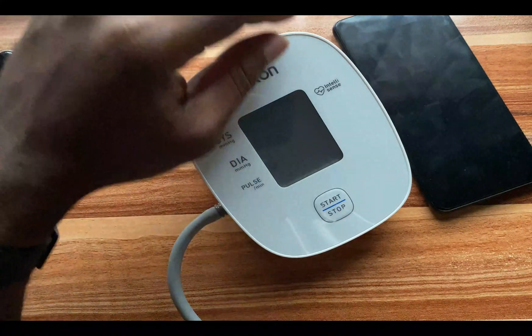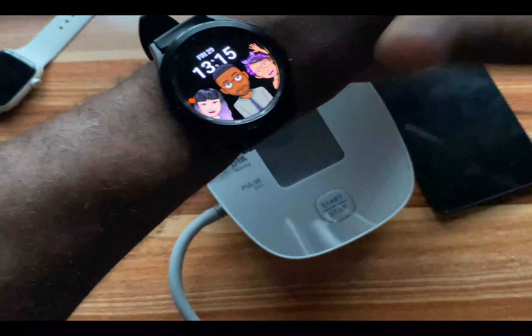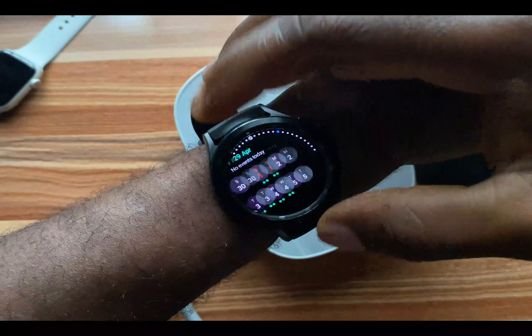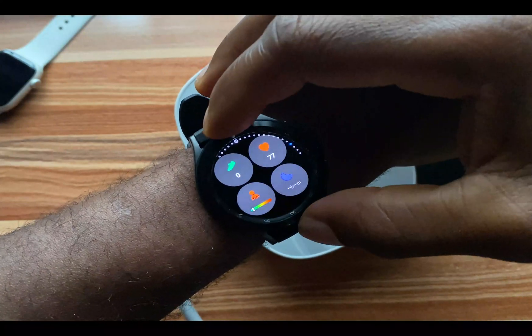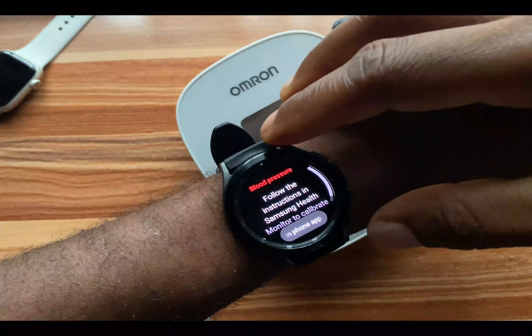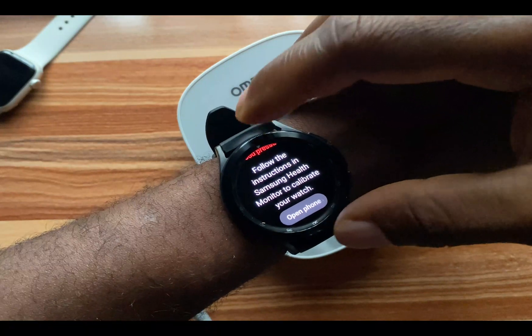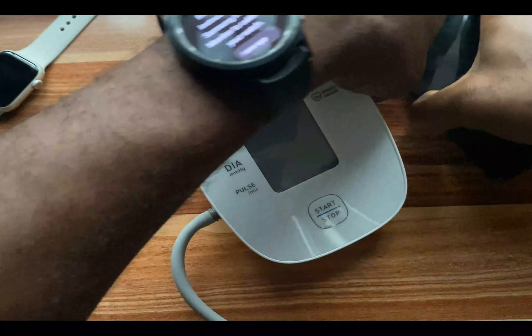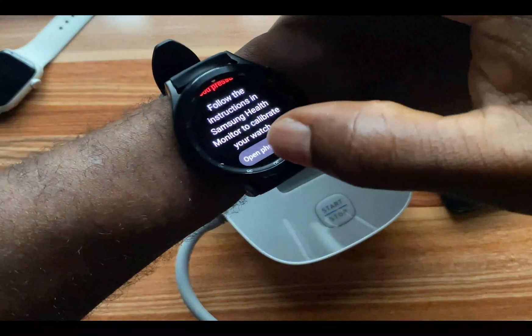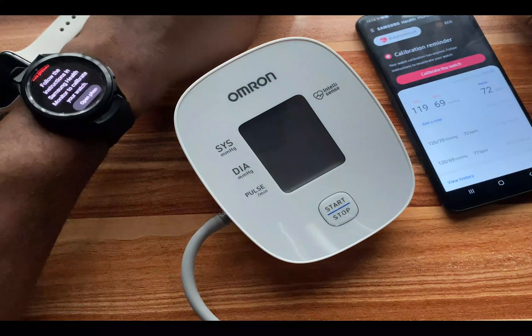We are going to calibrate the blood pressure measurement of the Galaxy Watch 4 Classic using this Omron blood pressure monitor. If I go to the blood pressure measurement feature of the Galaxy Watch 4 Classic and tap on 'Learn More,' it says to follow the instructions in Samsung Health Monitor to calibrate your watch. So I'm going to open up my phone and tap on 'Open Phone App,' which will automatically open up the Samsung Health Monitor app.